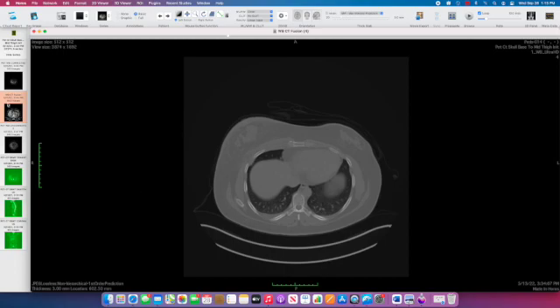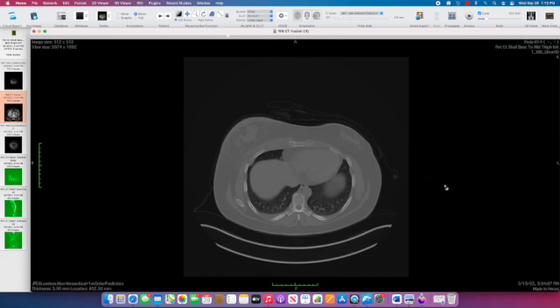In summary, this is a case of advanced right breast cancer with skin involvement, mediastinal and axillary lymph nodes, and lung and osseous metastases. That's it. Thanks.